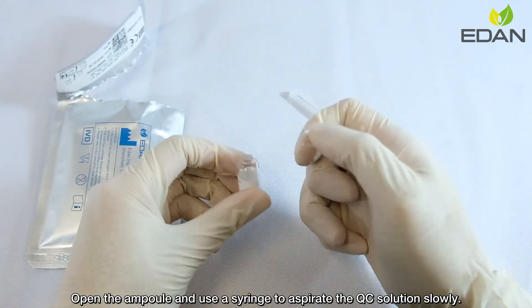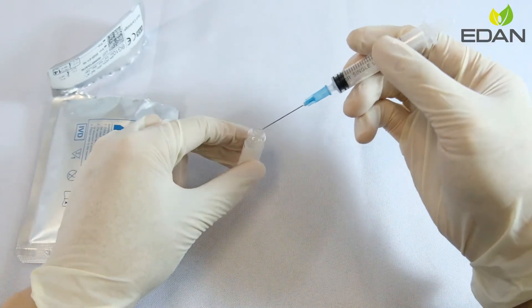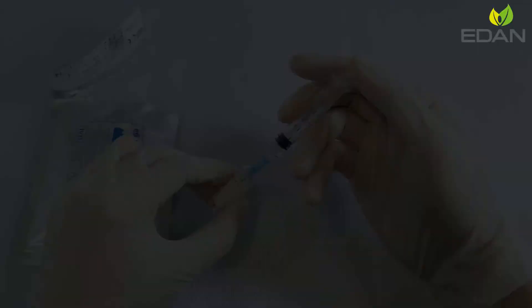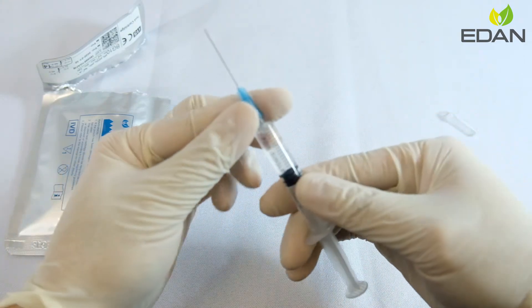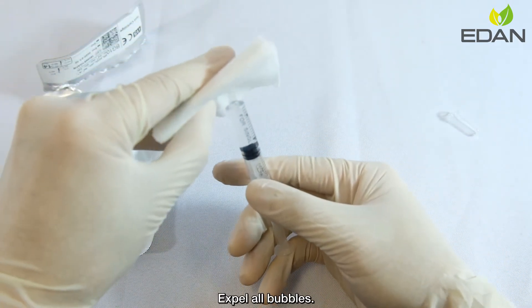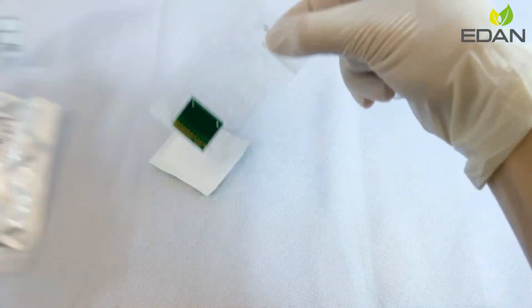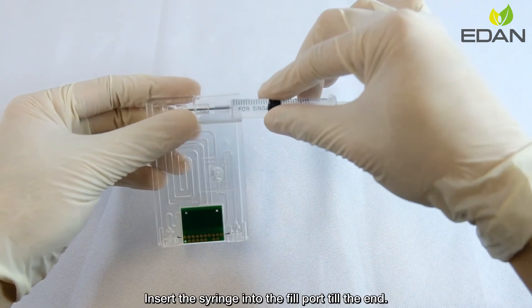Open the ampoule and use a syringe to aspirate the QC solution slowly. Expel air bubbles. Insert the syringe into the fill port to the end.